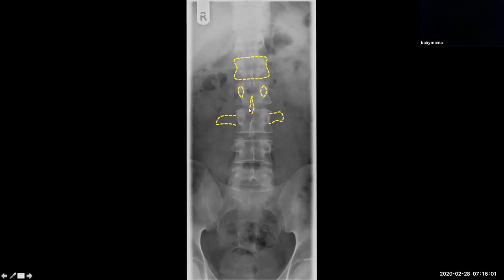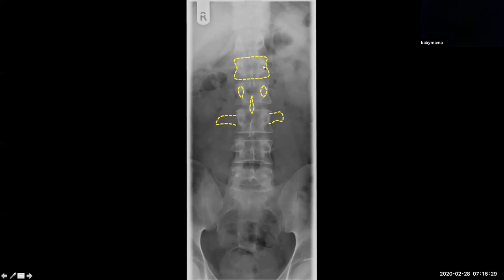Each vertebral body should also have a corresponding spinous process — the most posterior elements of the vertebral body — as well as the transverse processes, or the arms of the bodies. You want to make sure all these lines and cortices line up, including the spinous processes and the pedicles. If anything is out of alignment, you'll want to correlate with history and worry about things like trauma. If a pedicle is absent, things to worry about include metastatic disease or myeloma.